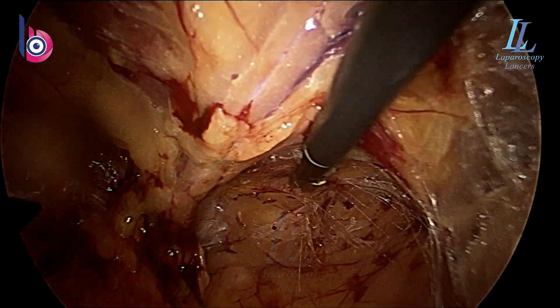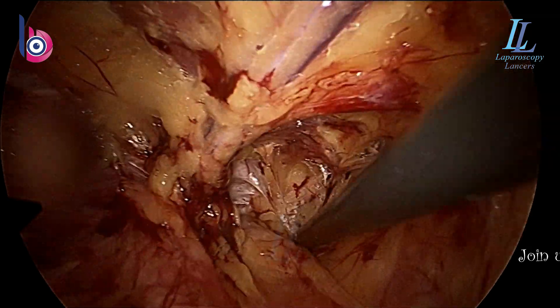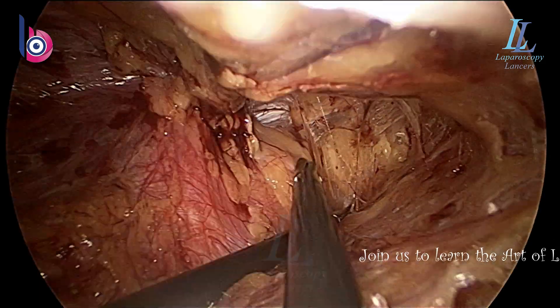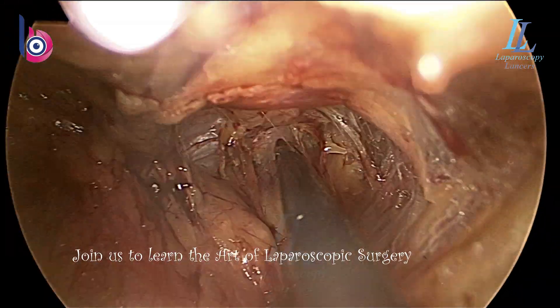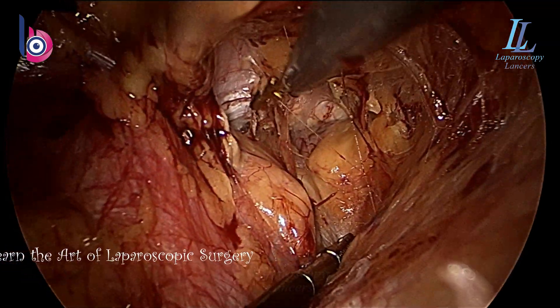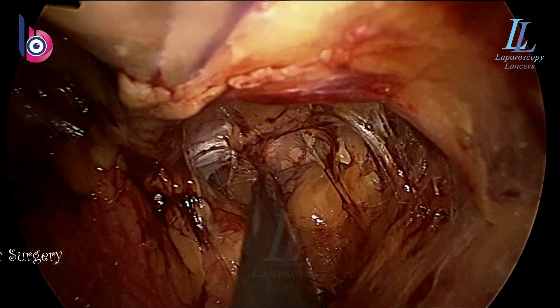There you can see the retropubic space. I'm already in the retropubic space, pushing the bladder down. We have not catheterized this patient. Generally, we do not catheterize the patient in the case of inguinal hernia surgeries. We tell the patient to pass urine just before the anesthesia, and the patient fares well without a catheter, as I prefer not putting a catheter in young patients or in any patient.